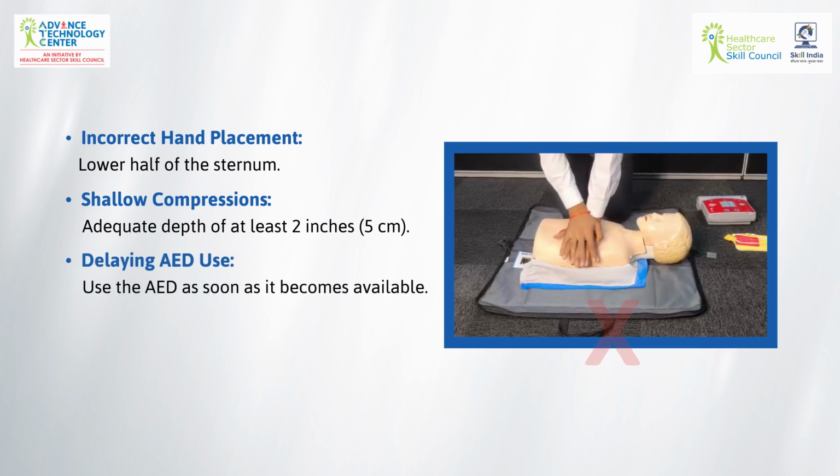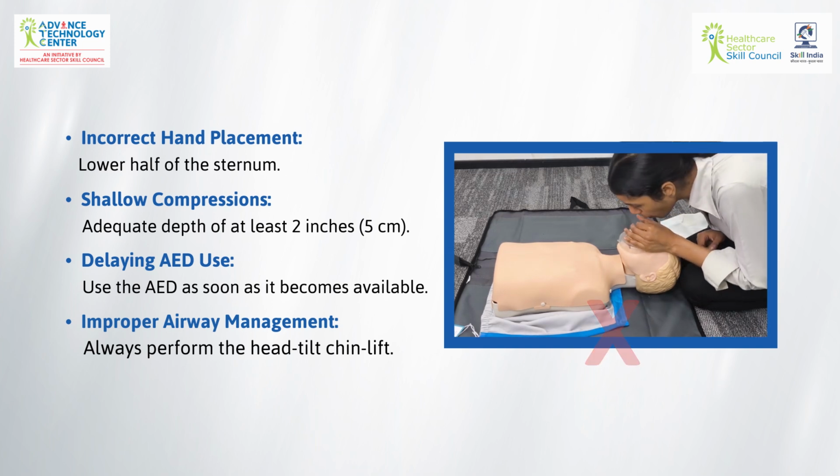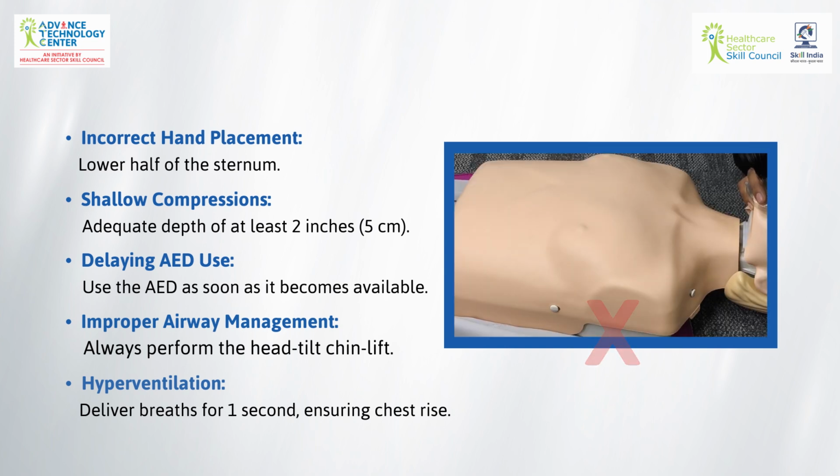Delaying AED. Use the AED as soon as it becomes available. Improper airway management. Always perform the head tilt chin lift unless a spinal injury is suspected. Hyperventilation. Deliver breaths for 1 second, ensuring chest rise.